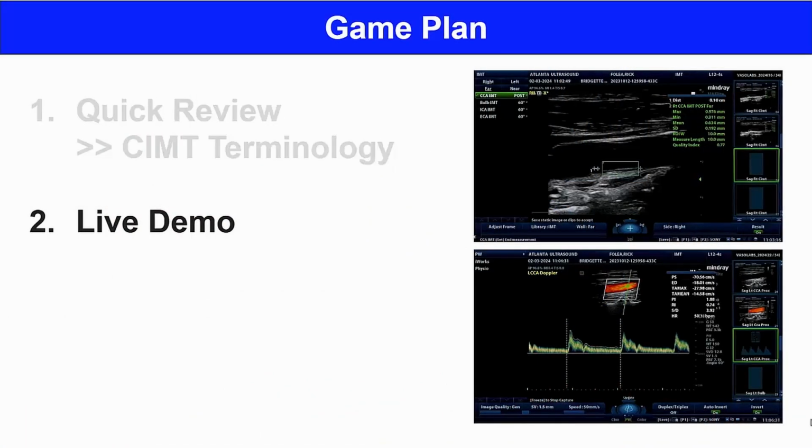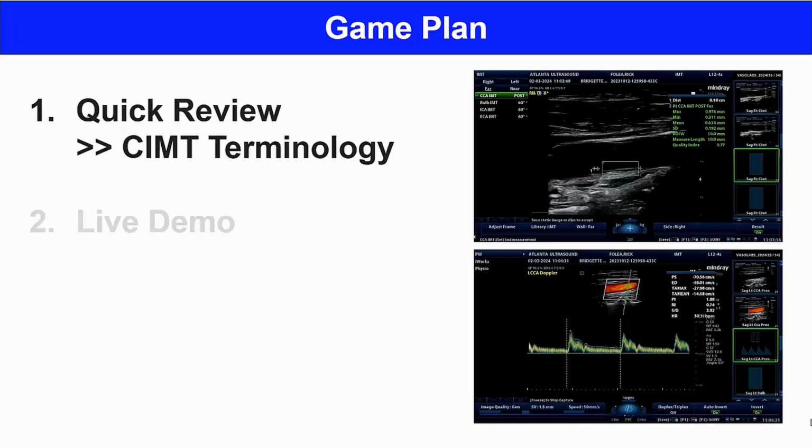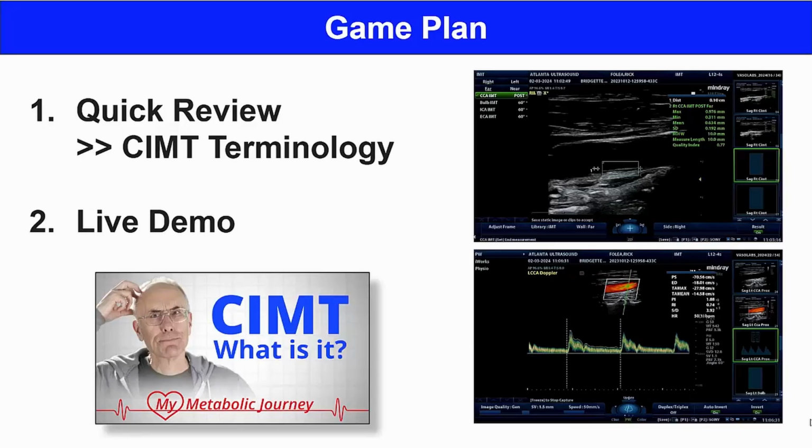Before we do our live CIMT demo, let's do a quick review just to get everyone oriented and on the same page with terminology. This video assumes you're already familiar with what a CIMT is and how it works. If not, I want to encourage you to watch this video first because we're not going to spend a lot of time here explaining what a CIMT is.